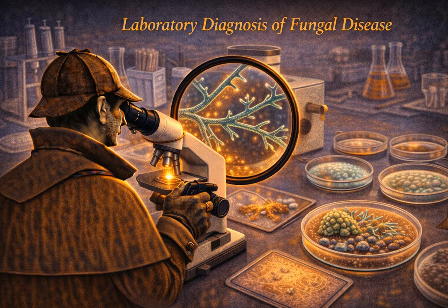The main takeaway is that fungal diagnosis is a truly multimodal discipline. You cannot rely on just one single test or swab. It is a layered defense. Step 1, the patient. Know the risk factors: neutropenia, HIV, DKA. That's your trigger. Step 2, the stain. Use KOH or Calcofluor for immediate visual clues. And remember, do not grind the Mucor.